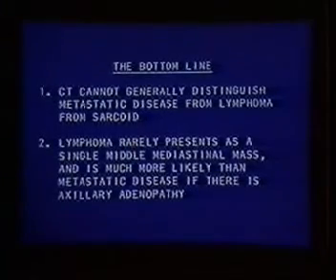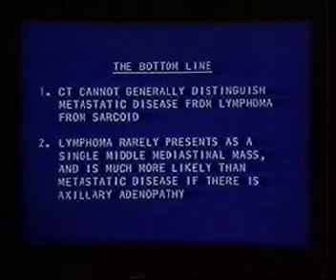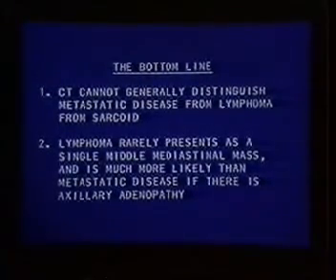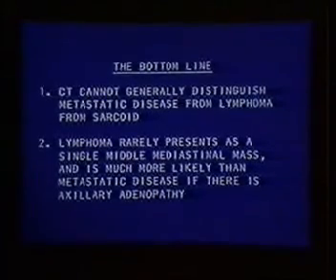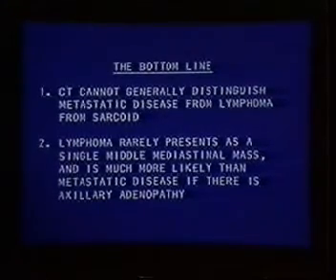I would say one thing for sure, that CT could generally not distinguish metastatic disease from lymphoma from sarcoid, and in fact could not distinguish metastatic lung cancer from other metastatic disease, could not often distinguish Hodgkin disease from non-Hodgkin lymphoma. There were a few guidelines we were able to come up with.